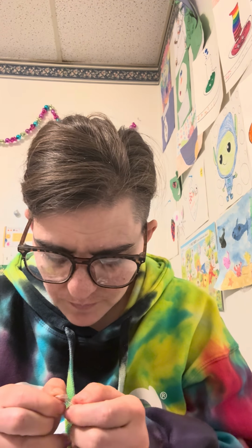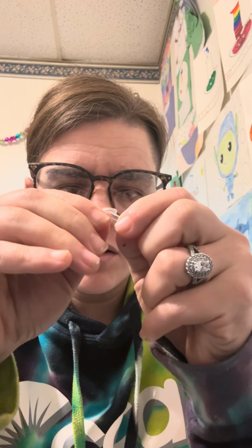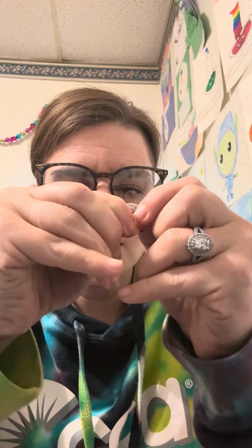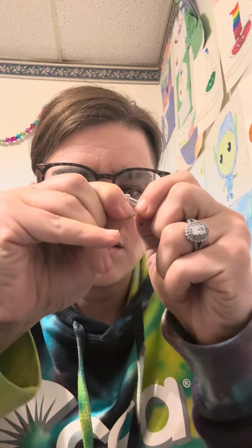But I also gave you some vital information as well. So hopefully you all are learning something. So again, I'm sticking this back on my hook. I took my hook off my hearing aid to give better leverage, like I said. And then you're going to stick your hook on here, hearing aid.